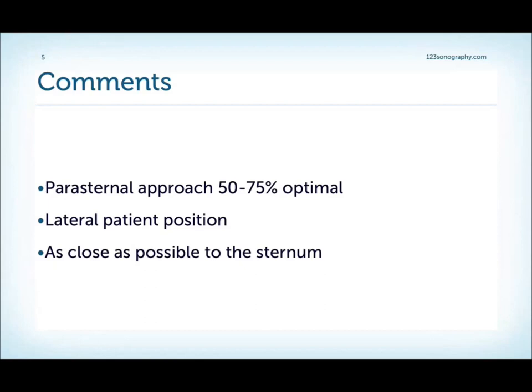Important to know that the parasternal window does not work in all patients, but usually you get image quality, I would say, probably in two-thirds of patients. Always bring the patient in a very lateral position and try to stay as close to the sternum with your transducer as possible.